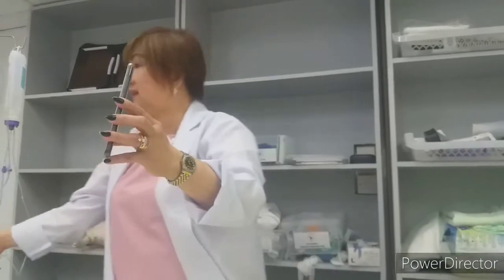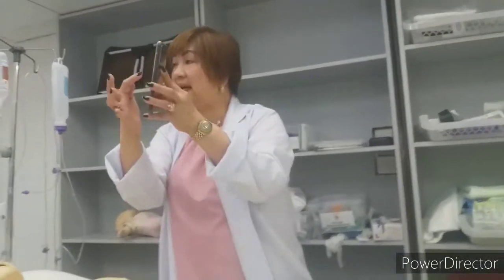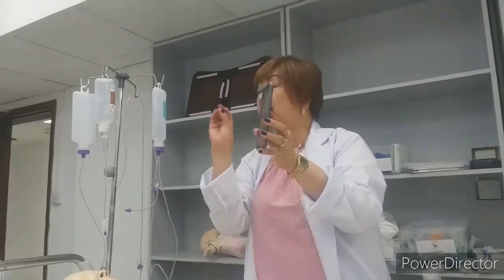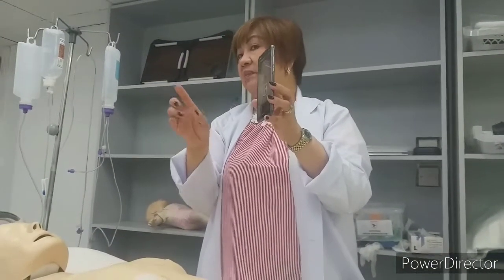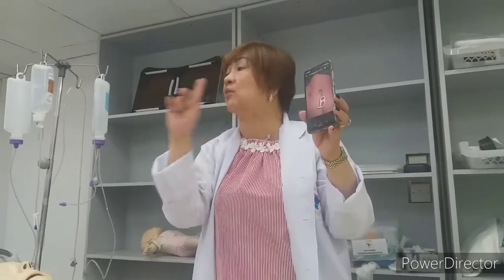This is what the clip is for, so that it will not flow through. The same, it is closed, but they put a clip. Only that, once it is dirty and infected, it will become red. So be careful to keep it clean and dry always, because once it starts to be pinkish, reddish, surrounding any wound, it means it is going to be infected soon.